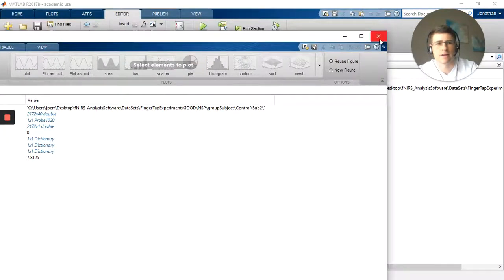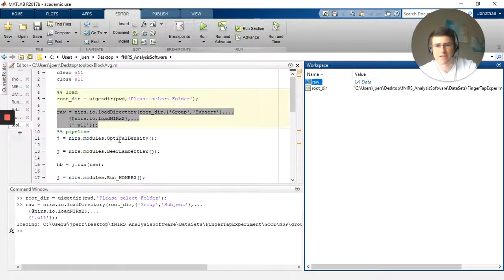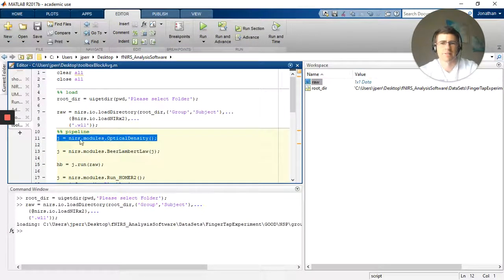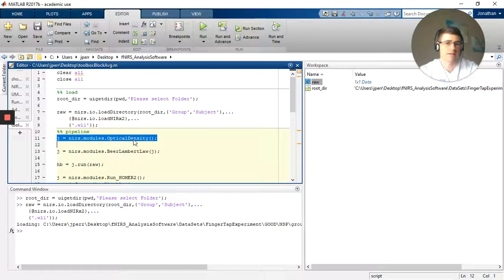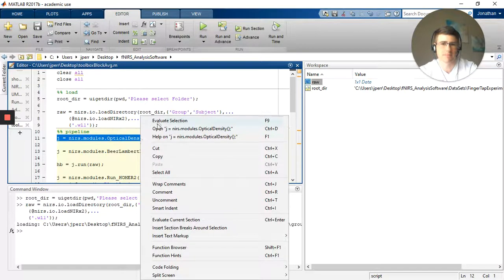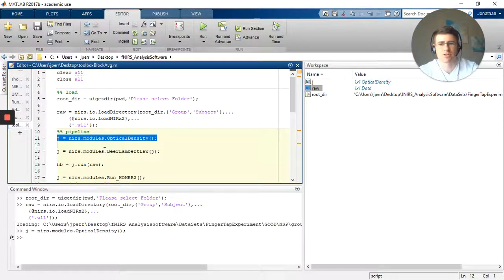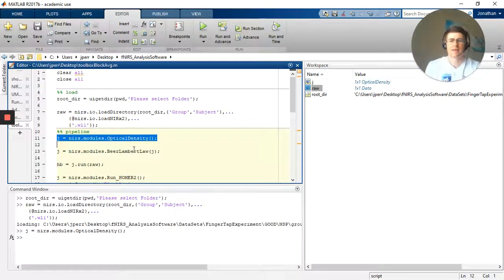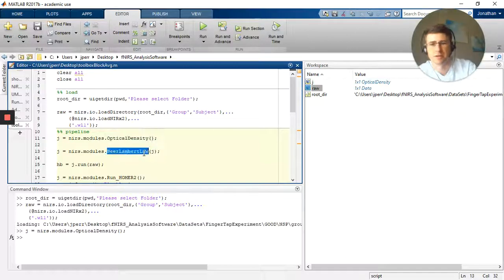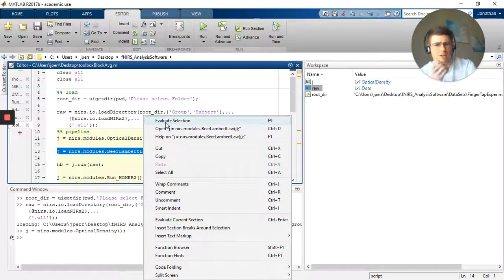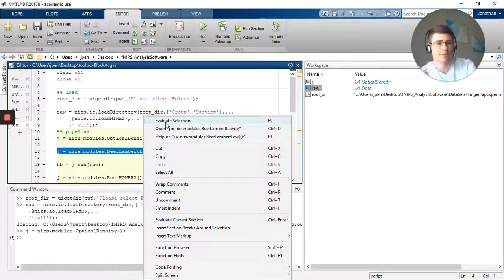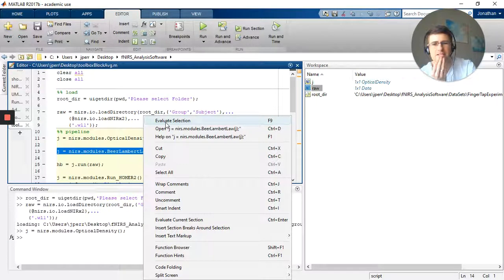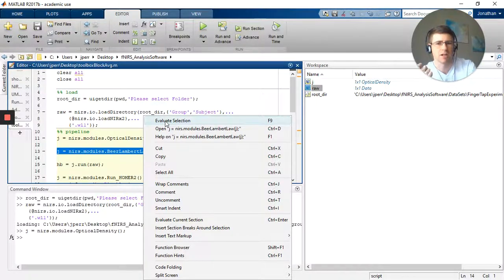So I can go ahead and close that, and then I start my pipeline. So I'm going to go to the NIRS folder, the modules subfolder, and I'm going to convert my raw data to optical density. I put nothing as the input because it's my first step. I save it as j, which will be my output of this step, and then I put it as the input for the next one, which is the Beer-Lambert law. Beer-Lambert law is going to take voltage, so change in intensity, in our case relative changes in intensity, and convert it to concentrations of some molecule.